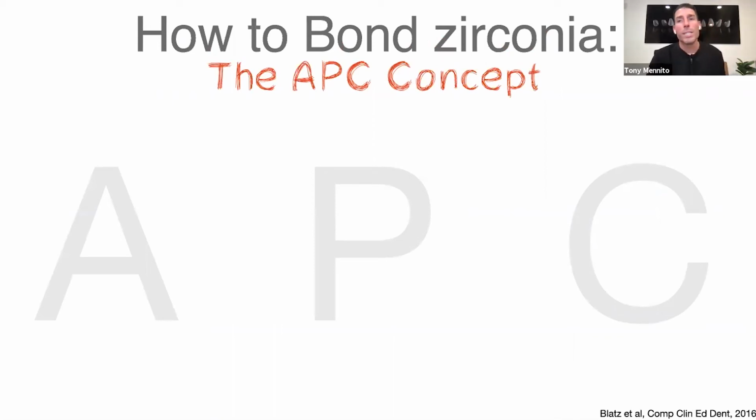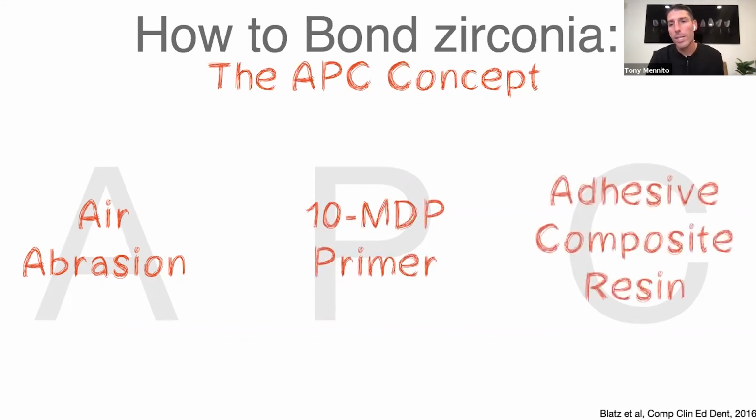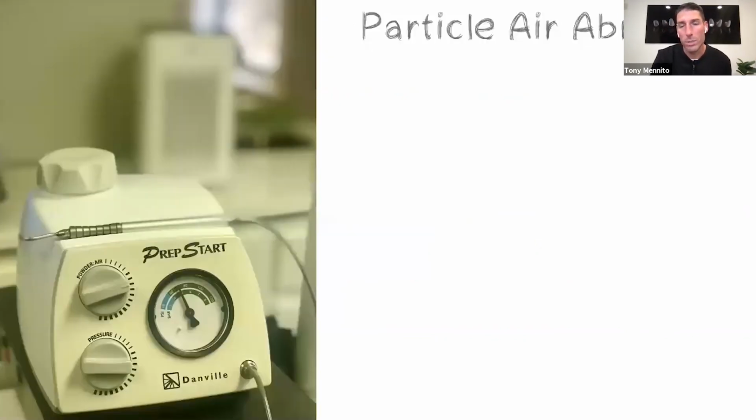So as far as bonding zirconia goes, this is really, really important to understand: you can bond to zirconia. It's a very specific workflow that I'm going to talk about briefly, and it requires 3 steps: air abrasion, all right, an MDP primer, and then your adhesive composite resin. Okay, so that is basically the protocol.